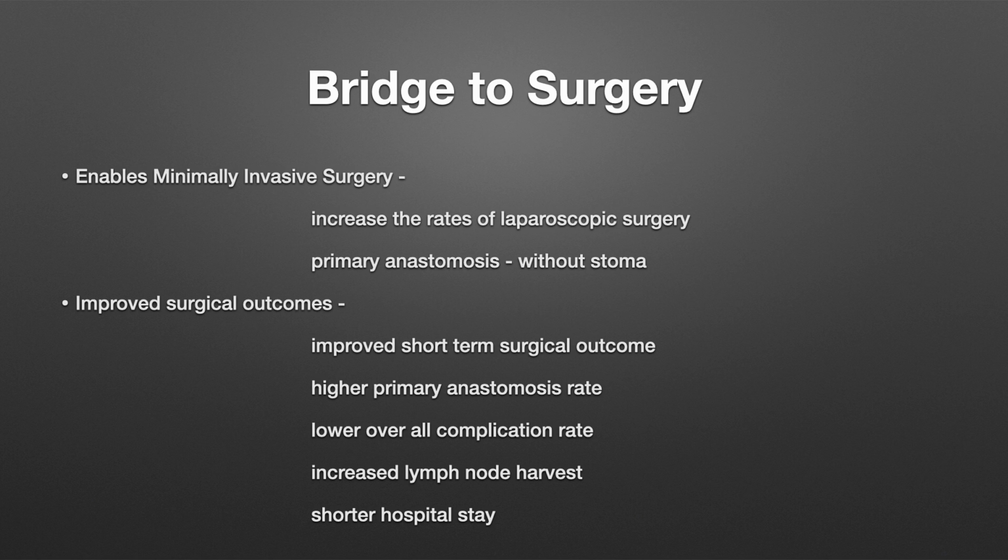Other advantages are that it enables minimal invasive surgery, which increases the rate of laparoscopic surgery, and primary anastomosis without a stoma, which is the most important feature, with improved surgical outcomes after bridge to surgery.